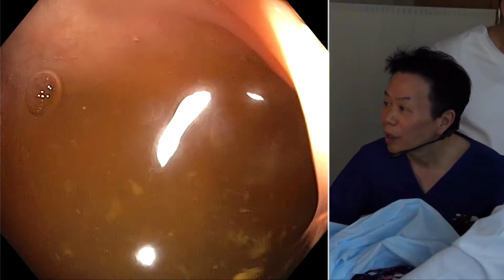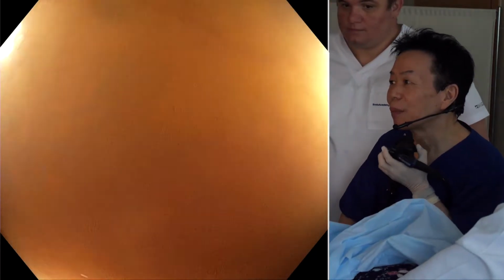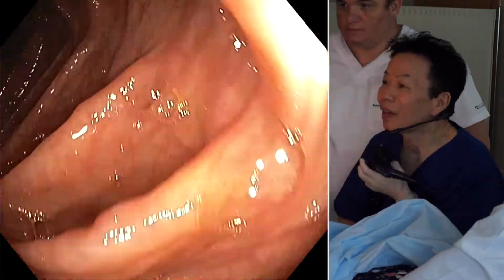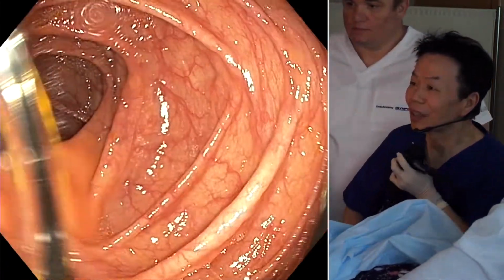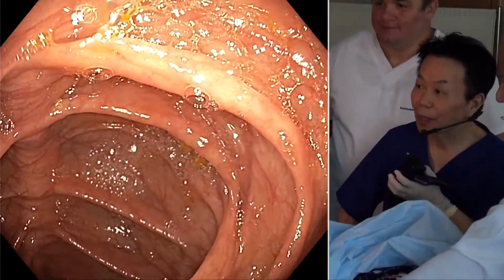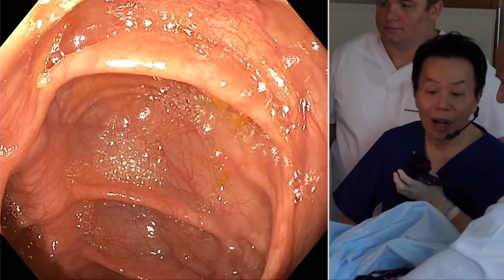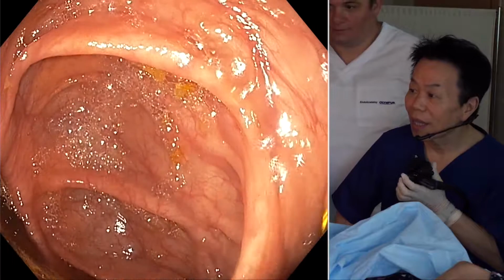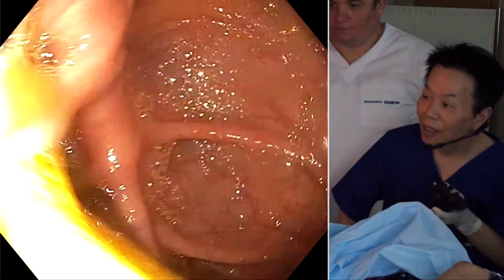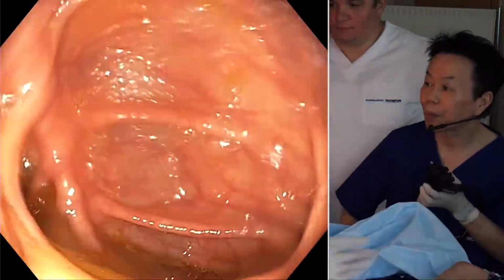In order to advance into the ascending colon, the colon should be straight enough. More on the right side. Yeah, now I can see the ascending colon and maybe the ileocecal valve. And I'm sucking air, and okay, release the hand. And if you cannot see the cecum well, maybe you can change the position of the patient again.